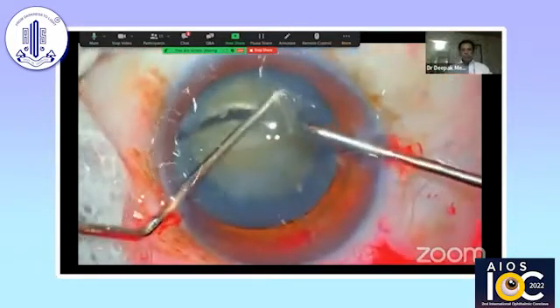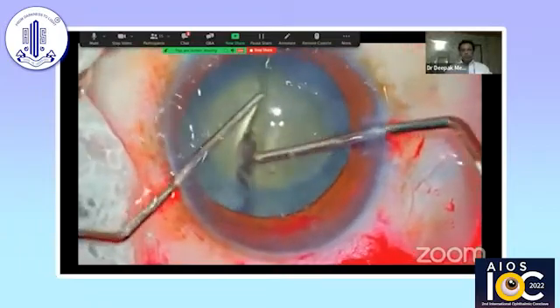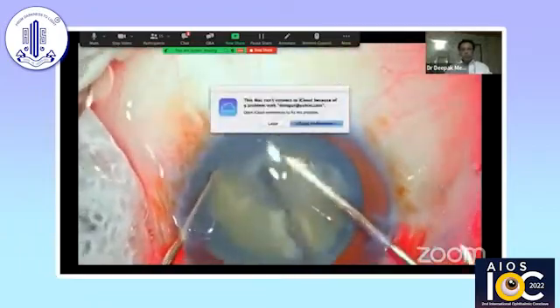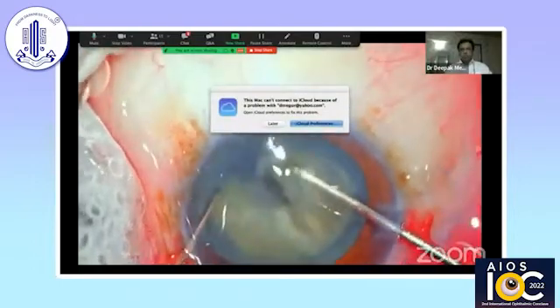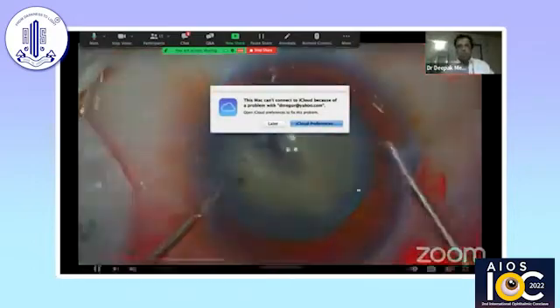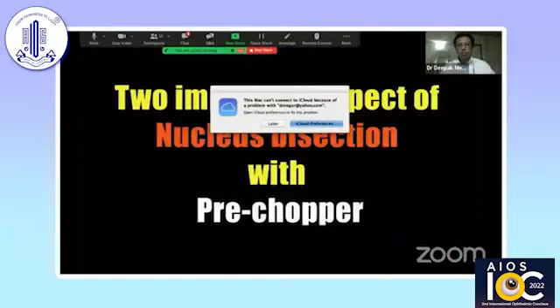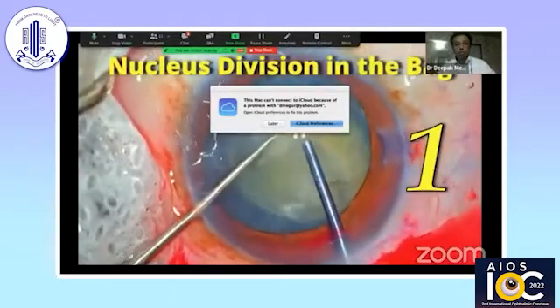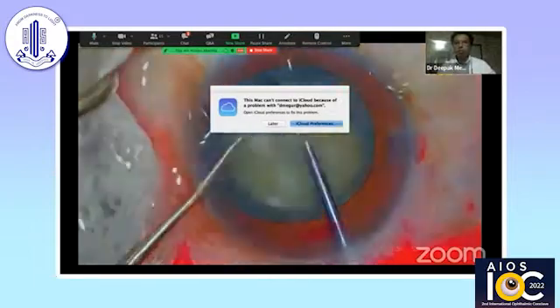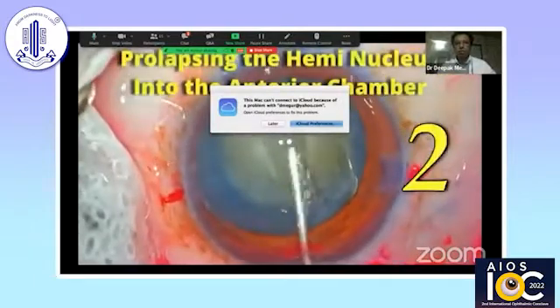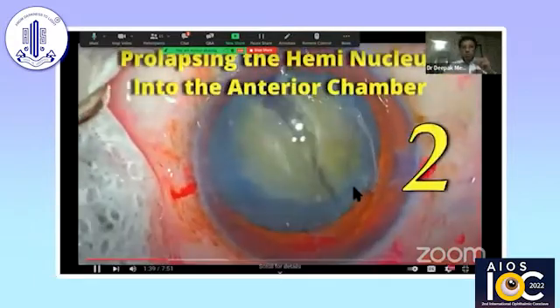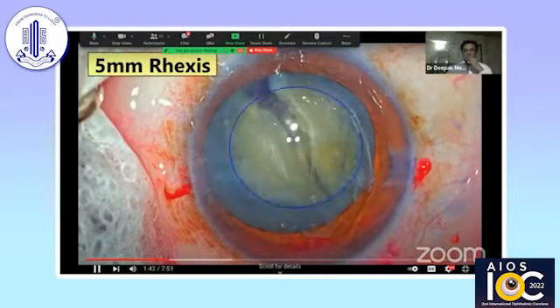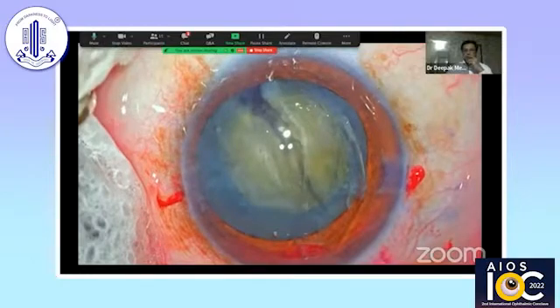I avoid doing more fragments because managing these fragments with all sharp edges is going to be slightly traumatic to the corneal endothelium, so I don't see much advantage of dividing into very small fragments — dividing into two fragments is good enough. There are two aspects to nucleus management with this technique: one is dividing the nucleus using the pre-chopper, and the second is manipulating these fragments out into the anterior chamber.